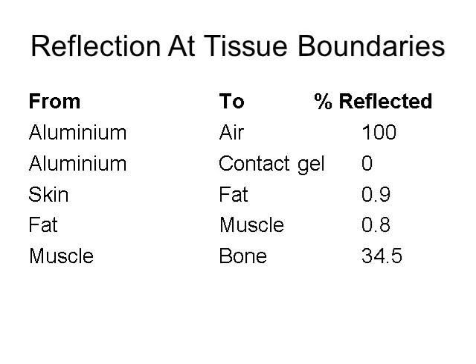The conduction between skin and fat and muscle is very good, with little reflection at all. Conduction between muscle and bone, however, is poor, with just over 1/3 being reflected back. This is therefore a risk area for the setting up of standing waves.